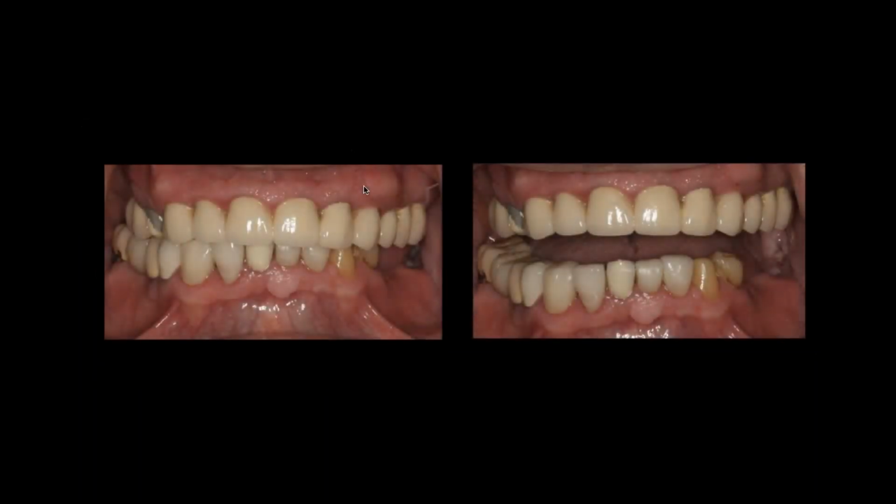This was a case that we redid, one of the doctors and myself here at Staten Island, Dr. Bernadette Sava. And what's interesting about this case is the patient presented with previous restorations. And you look at these restorations, and I think it's pretty obvious when you look at them that they have that PFM look. But is it really a PFM look, or is it really just a poorly layered restoration?